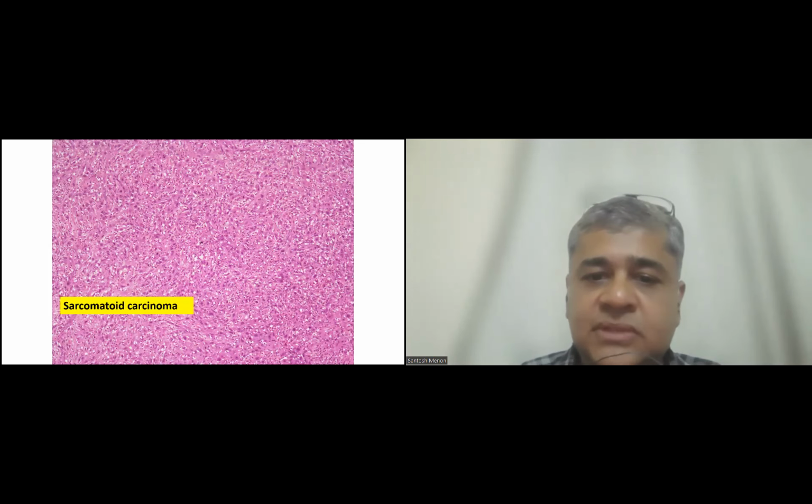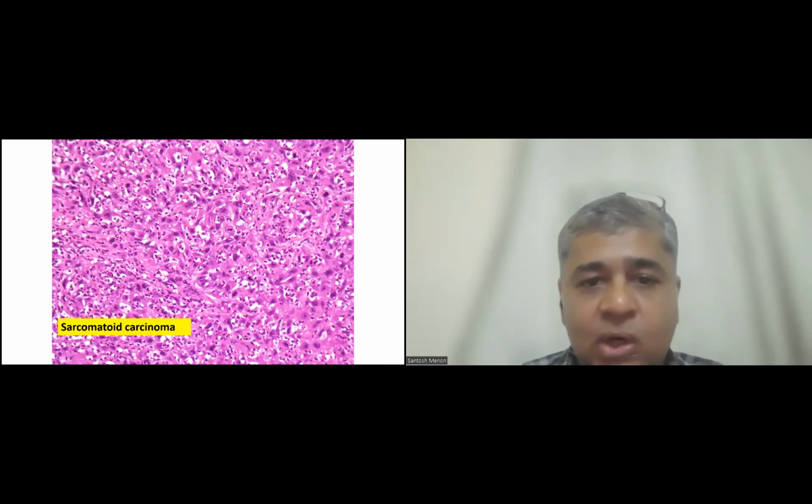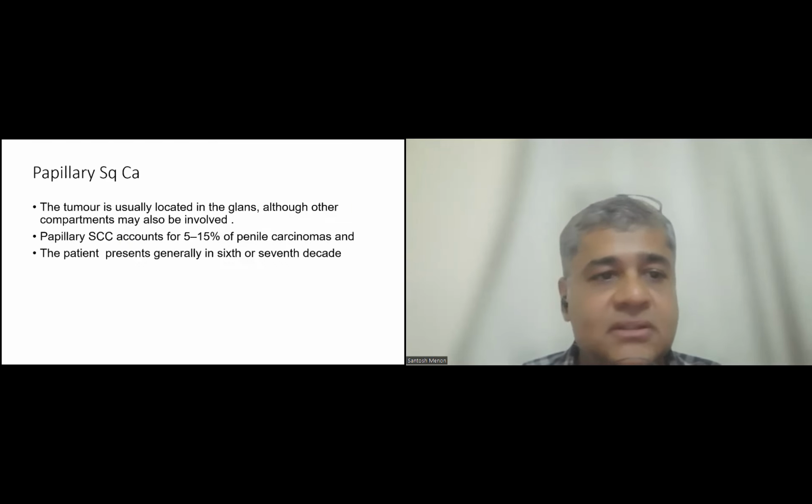So these are pictures of sarcomatoid carcinoma. They can have a lot of inflammation in between, especially neutrophilic infiltration in some cases, and they may start resembling an angiosarcomatous pattern. Mind you, keratins may not be strongly positive. They may be focal, and you may have to repeat your keratin stain, EMA stains, and other stains on several slides before you can actually demonstrate it.